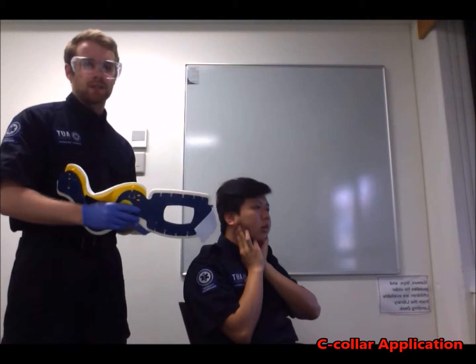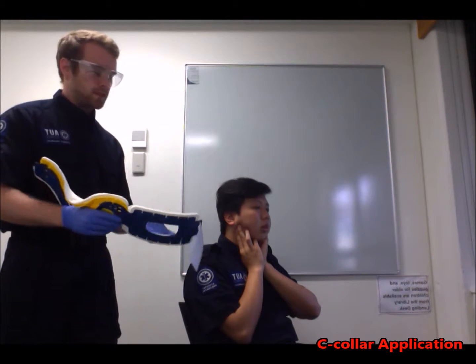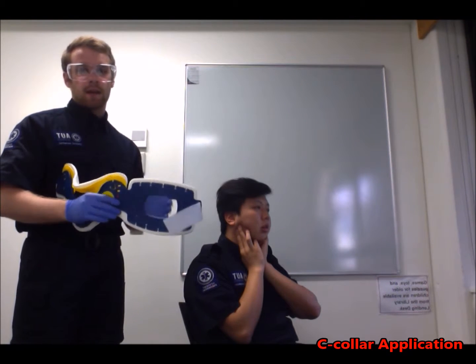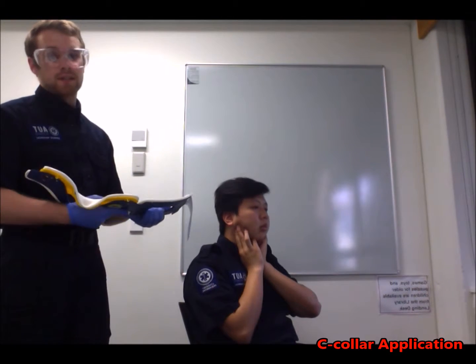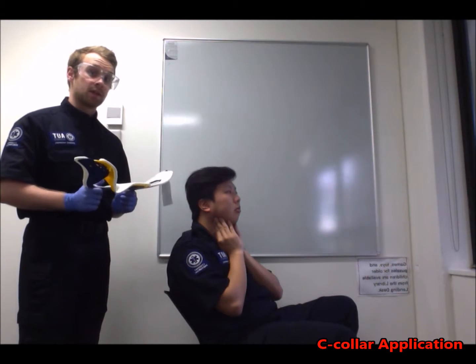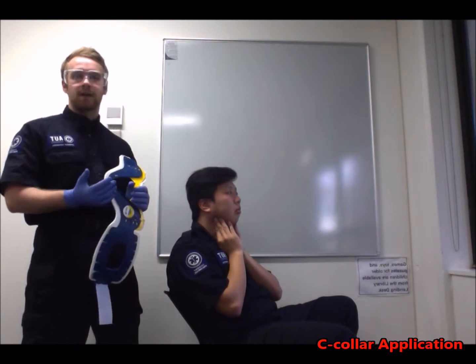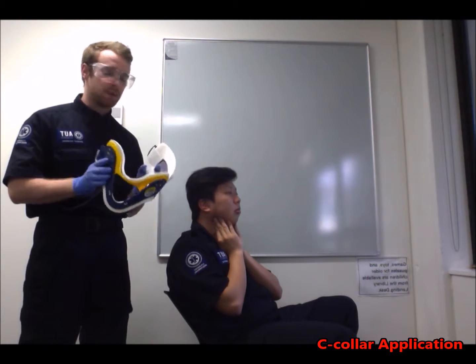There also may be a decrease in the level of alertness, or a neurological deficit, which may dampen the feeling to the lower extremities. There may also be distracting, painful injuries in addition to the C-spine injury. So Bruce here is my patient, and I'll be performing a NEXUS assessment before applying this. A NEXUS assessment may not indicate that a C-spine collar is necessary. However, depending on the mechanism of injury, this may change the likelihood that a C-spine collar is actually necessary. So it's better to be safe than sorry.